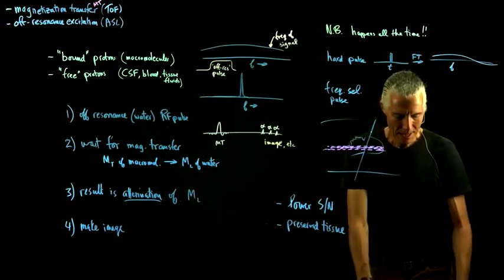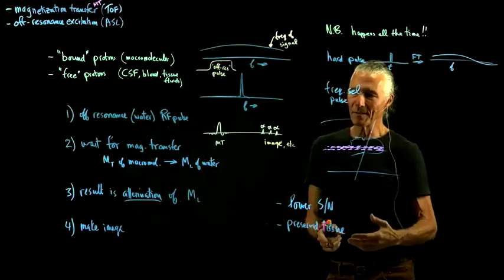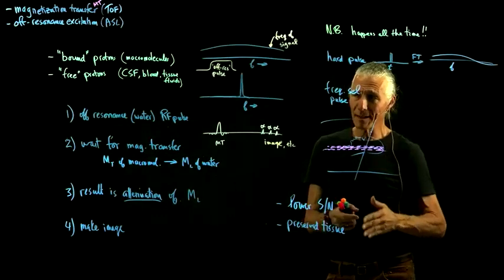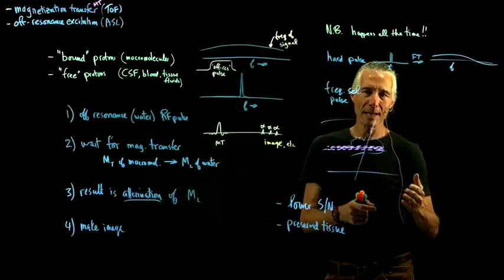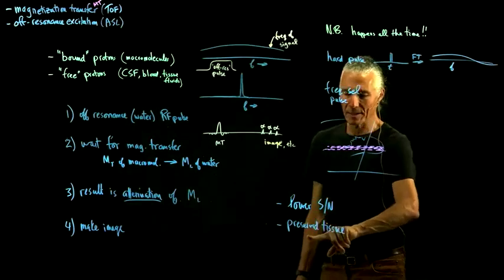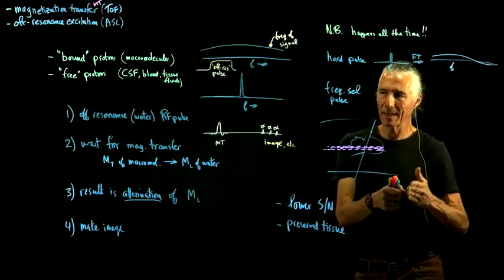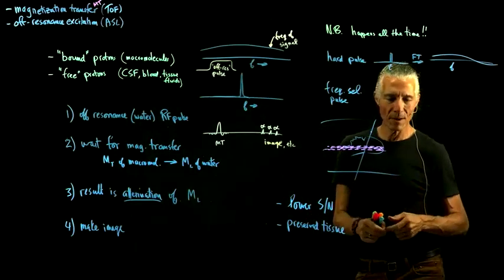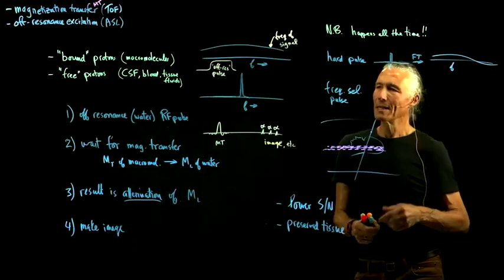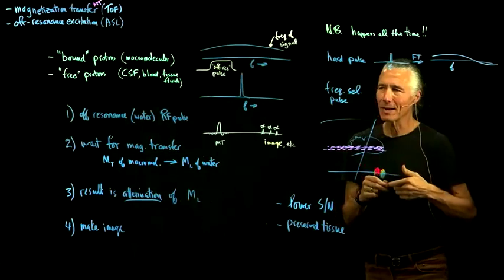But why, since we have methods, if the brain is dead, we could slice it up, section it up, stain it, and look at it that way. Why would you want to scan it instead of just preserving it and sectioning it? One of the problems with sectioning it, especially a human brain, is that it's really big. How many sections are there in a brain?